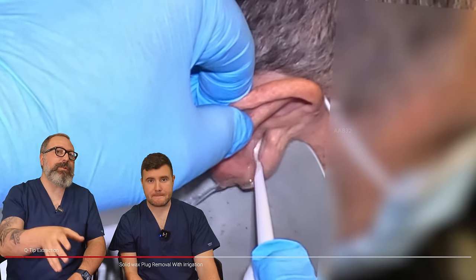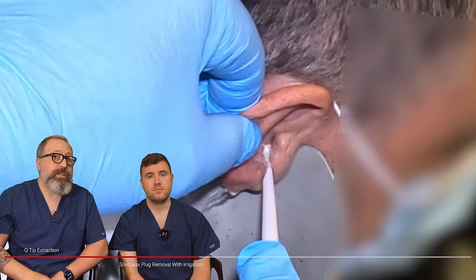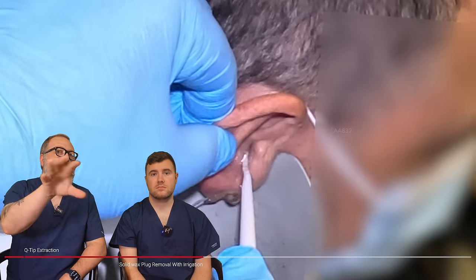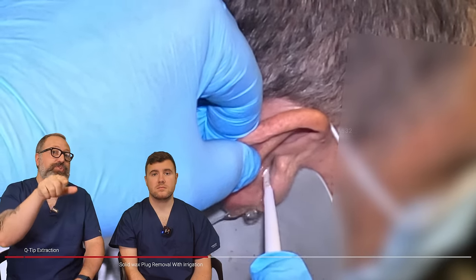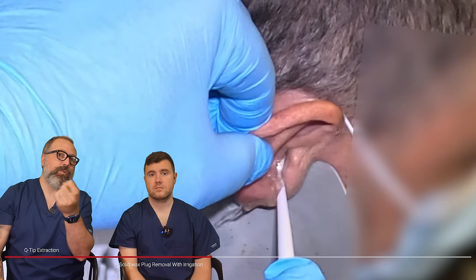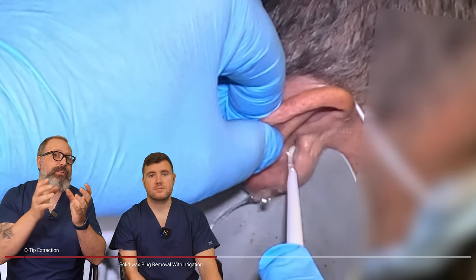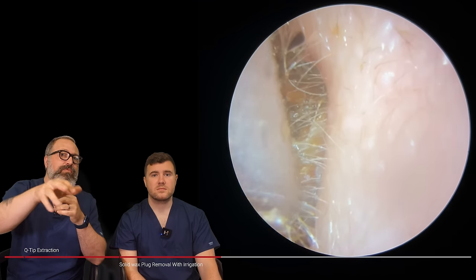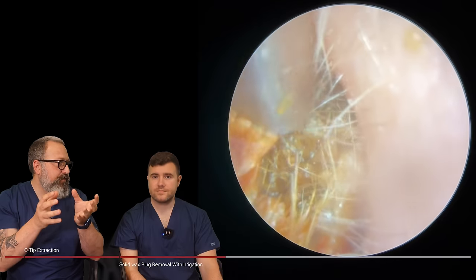You're not going to see a tremendous amount coming out in this first part — basically what we're doing is just softening this wax up, and this is actually in real time. So this is exactly how long we spent in the patient's ear canal irrigating — I think we're in there for probably about a minute altogether. You can see we've got the little pot underneath, which is just catching all the water and debris that comes out of the ear canal. The irrigation tool itself is in the ear canal — it doesn't go in straight, it's got a little hook, a bit like the St. Bart's hook. You angle that to the roof of the canal and wiggle it back and forth.